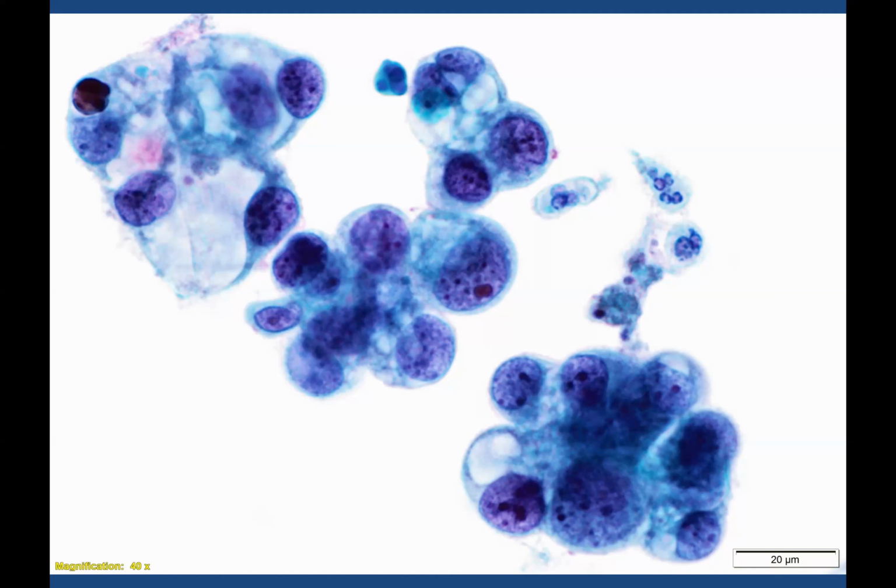In this instance, this was a case of endometrial adenocarcinoma. We've got these balled up clusters of cells with a nice clean background. On its own, what would I be thinking about? Well, it could still be a case of invasive cervical adenocarcinoma, but when it doesn't look like your usual high-grade CGIN, you've got to think, could this be extracervical?